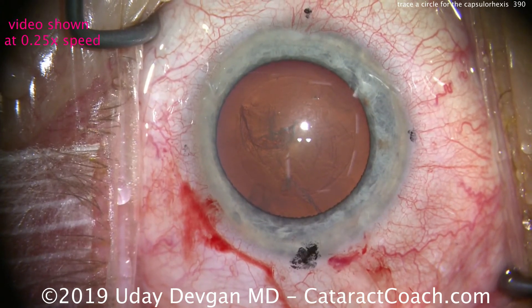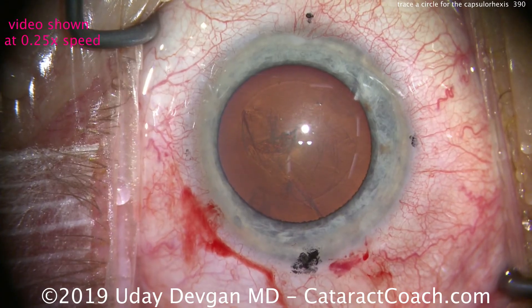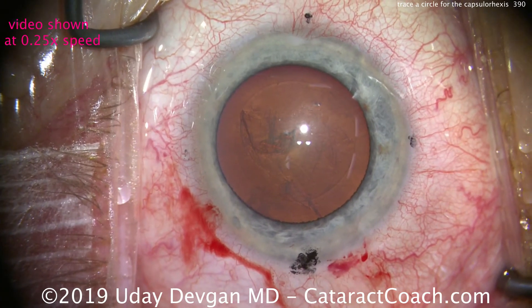Let's watch the same video again, this time at normal speed. You can see we end up with a 5mm capsular rhexis that is just perfect.